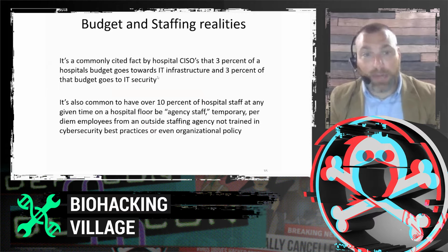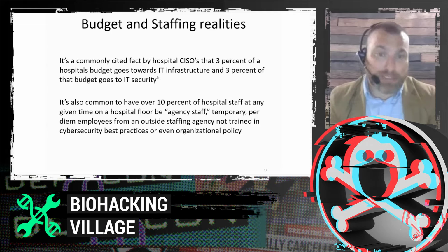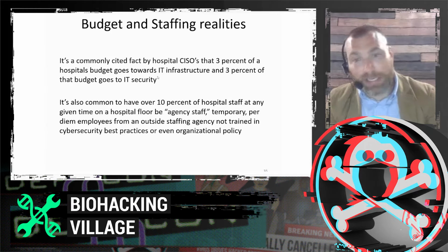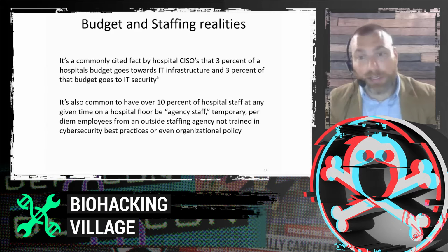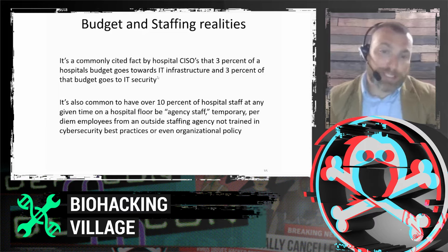One of the things that complicates this is budgeting and staffing realities. It's commonly cited by CISOs from hospitals that 3% of the hospital budget goes towards IT, and 3% of that 3% goes to security. So they really don't have a lot of either the staff or the resources that they need to dedicate to security. That leads into one of the reasons why we built this course, to try to offer some free technology, in this case free training, or low cost technology that could be used to secure a hospital's network.